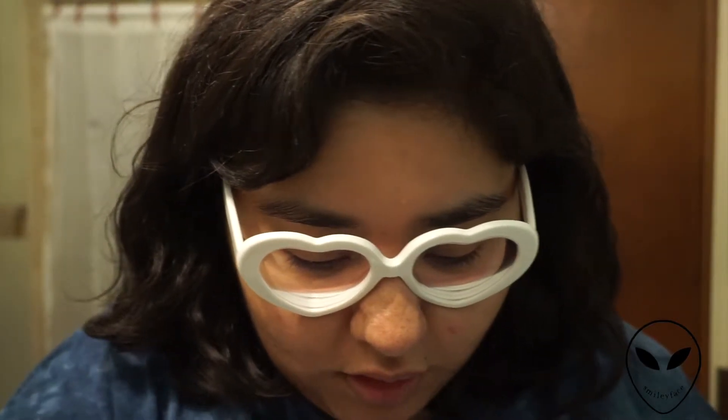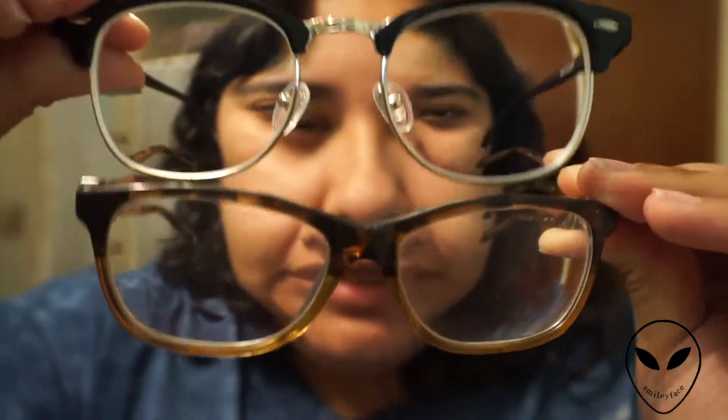Let's compare them all. These are my originals — pretty standard, much smaller, you can see my eyebrows. Then there's my 60s pair, a little bit bigger — you can see the tops of my eyebrows, I'd say they're taller. And then these big ones just kind of consume my face. But I really love them.